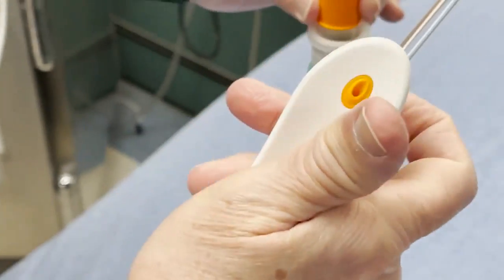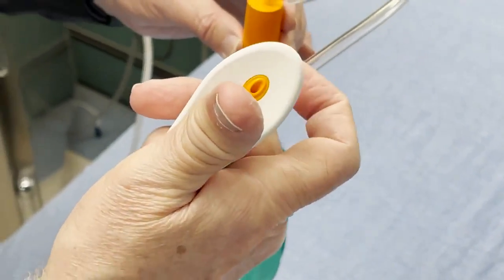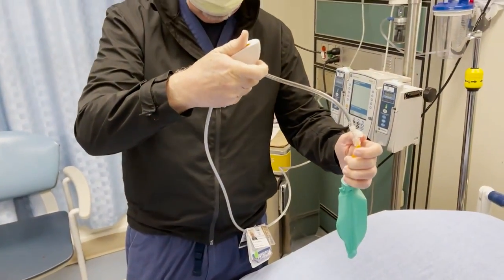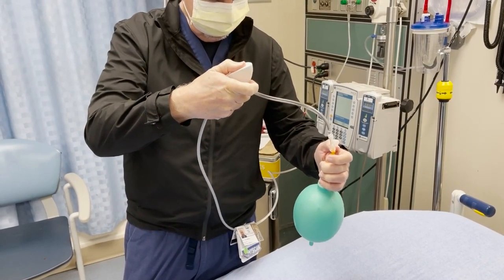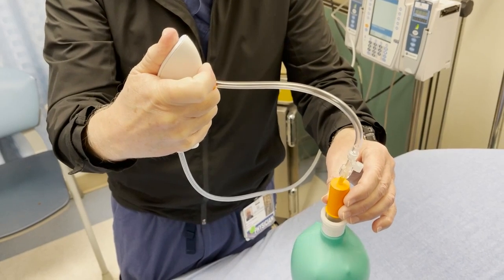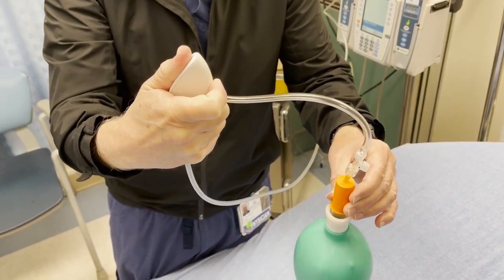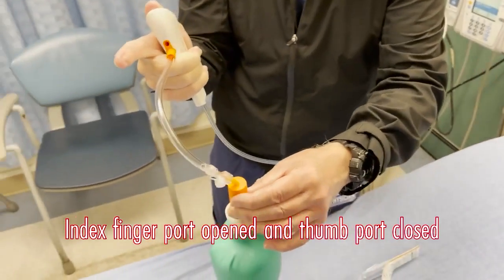So that's the 14-gauge catheter with the luer lock adapter. This is where the active sucking of air comes out. So this is sucking the air out — you can see it. Now I'm putting air in, ventilating. Active ventilation, active expiration, then passive expiration.